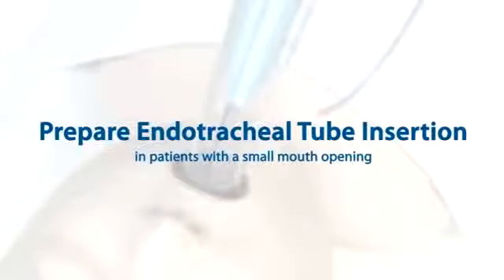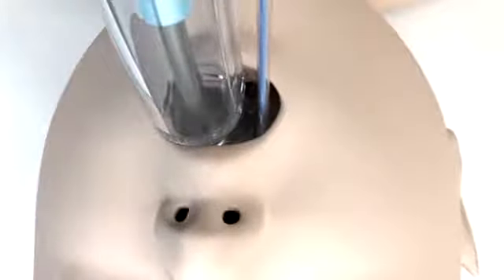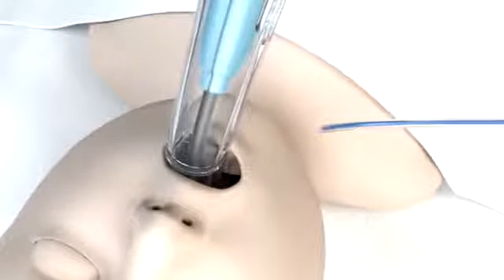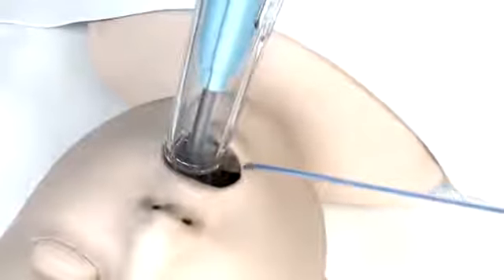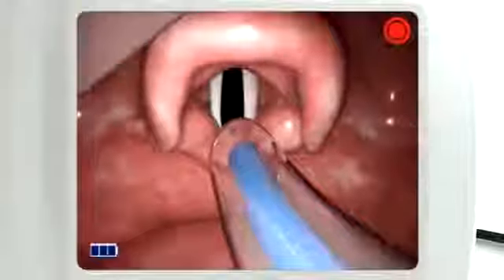One technique for working with the infant that has a small mouth opening is to move the stat over to the left slightly, giving you more space to introduce the endotracheal tube. The endotracheal tube should be placed adjacent to the stat and then advanced into the glottic opening. Another tip is to have the endotracheal tube enter from the corner of the mouth, being very careful that you observe the placement of the endotracheal tube to avoid any trauma to the soft tissue. Once proper ETT placement is achieved, turn the endotracheal tube to the 12 o'clock position, adjacent to the stat. Then look at the screen to intubate.